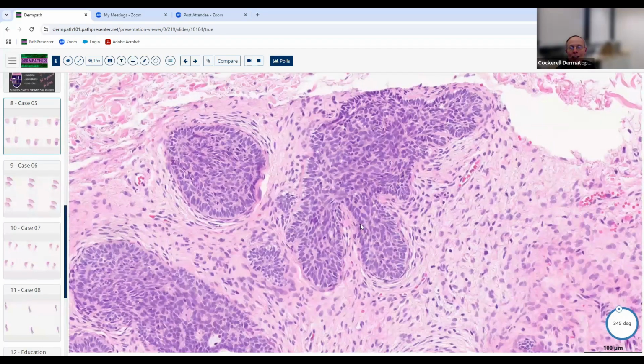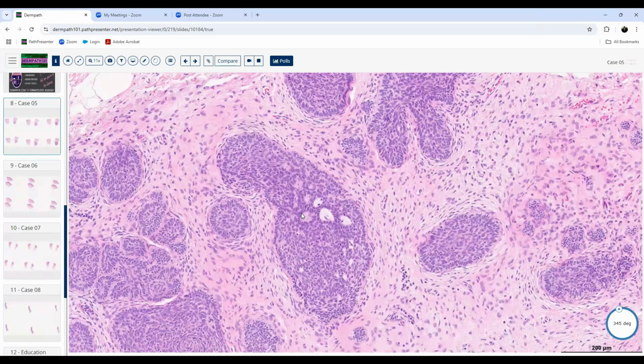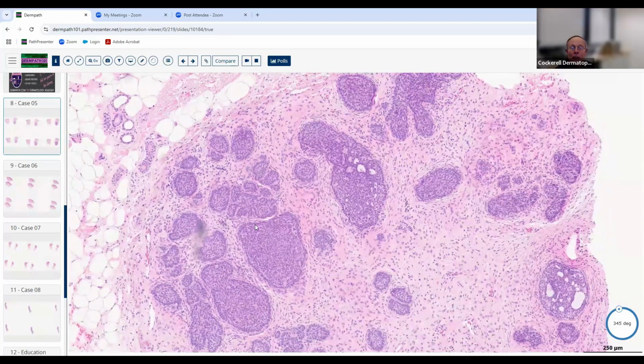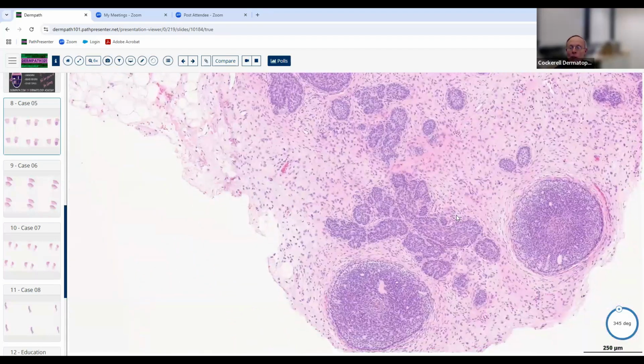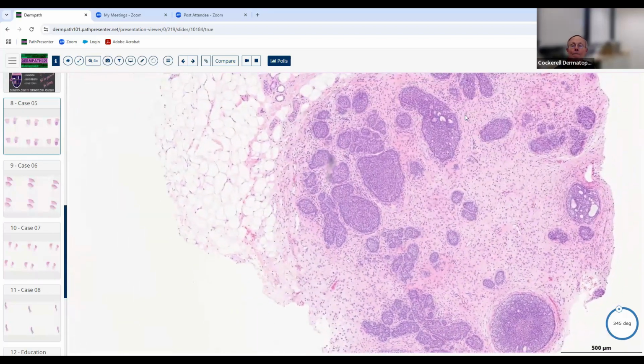You know it, you're just not saying it. Talking about like the hair follicles, surrounding hair follicles? Good, follicle. Hair follicle. This is a little papillary mesenchymal body here. That looks like the dermal papilla, the hair follicle right there. So yeah, this is a primitive follicular neoplasm. Good. And I agree that it's benign.